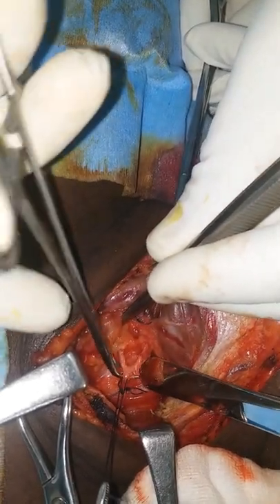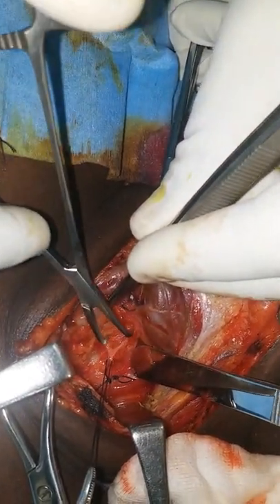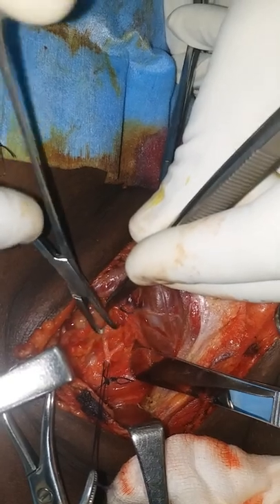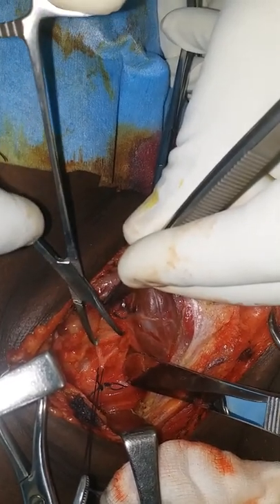What I have taped is the inferior thyroid artery. The nerve may be somewhere here. I will try and demonstrate it as I proceed.